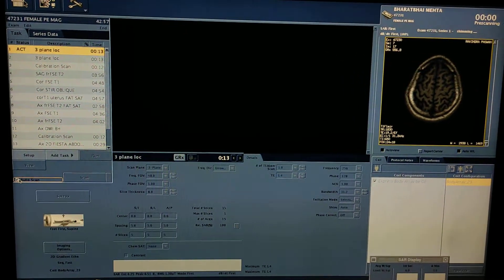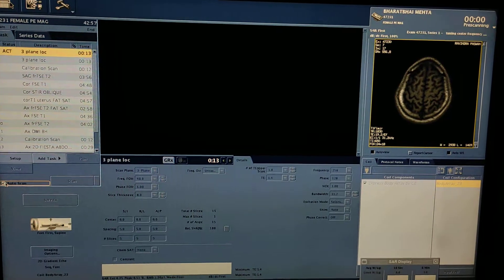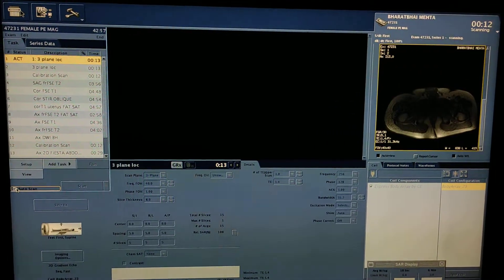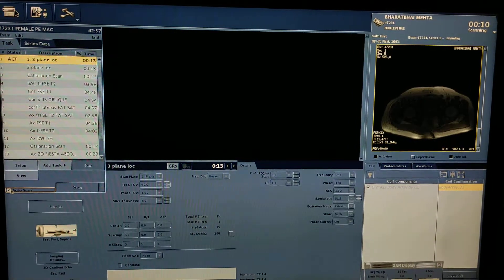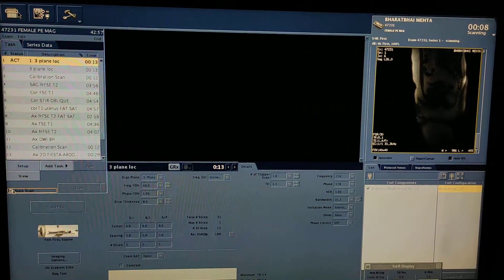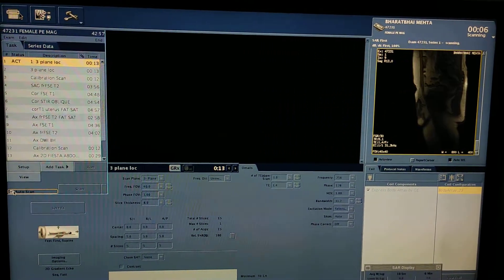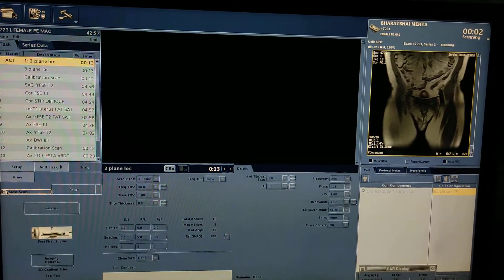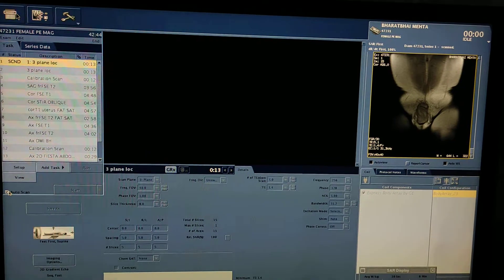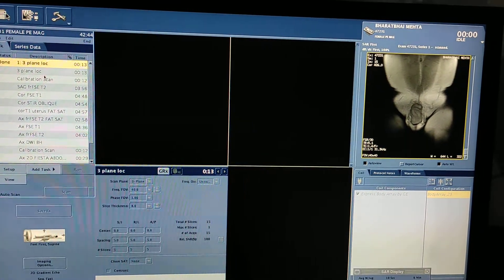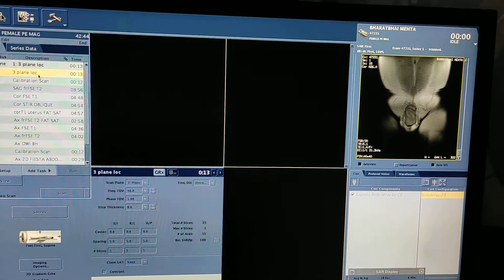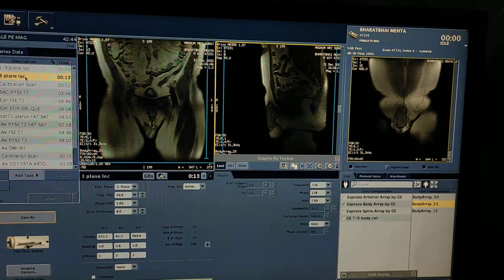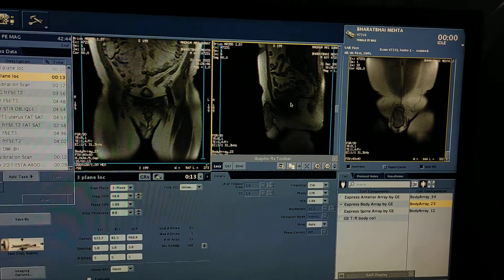Whenever you are going to do MRI, before scanning always take a proper history. Check sonography reports, check blood reports, check serum creatinine, because you are going to give IV contrast. The sonography of the patient is suggesting an enlarged prostate and PSA level is 21.